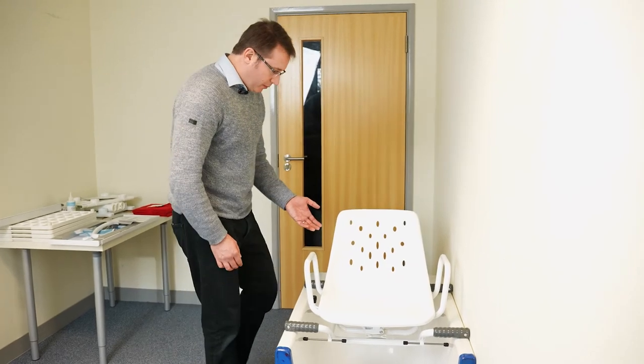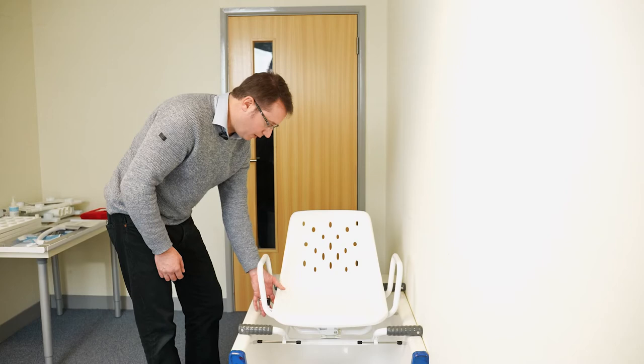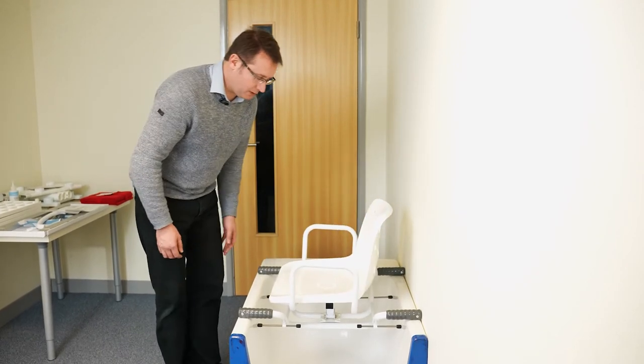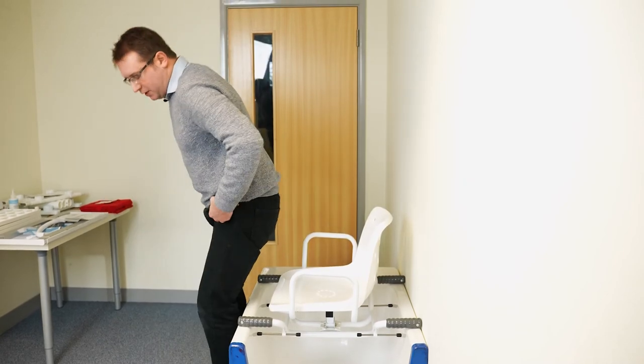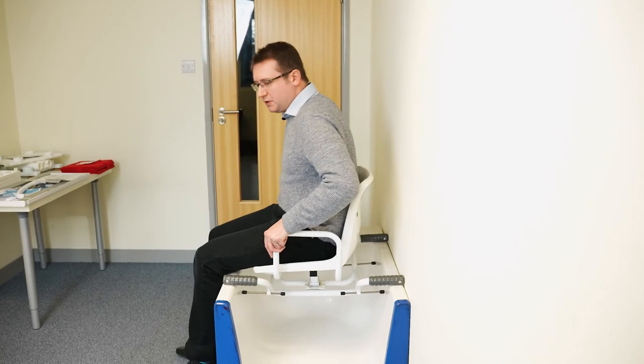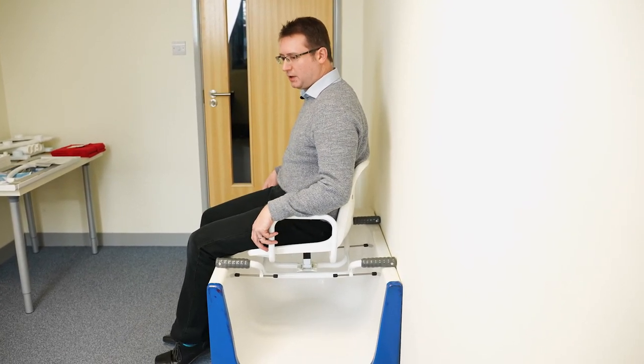For the client to use the Ultra Swivel Bather, they first need to turn it so it faces the outside edge of the bath. Lift the locking lever slightly and swivel the seat — the locking lever will lock back into place. The client turns around, puts their hands on the armrests, lowers themselves onto the seat, and may shuffle back a little to be fully seated.